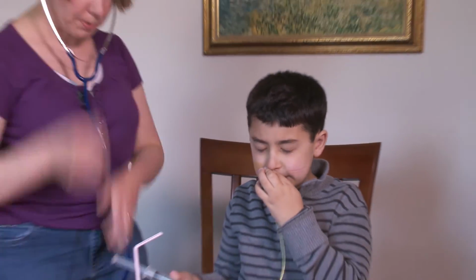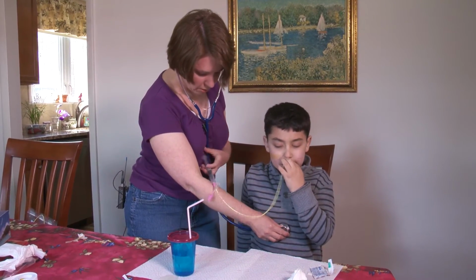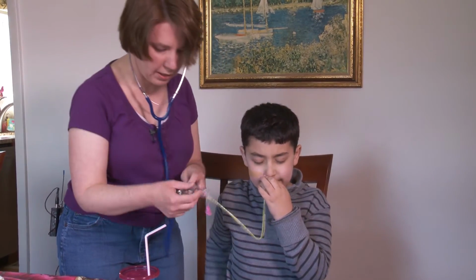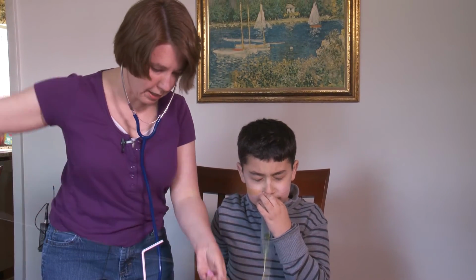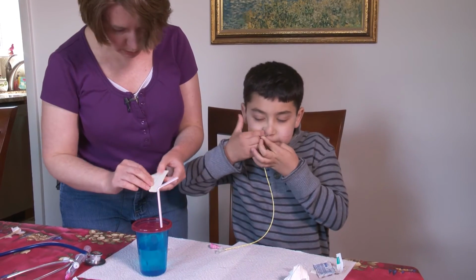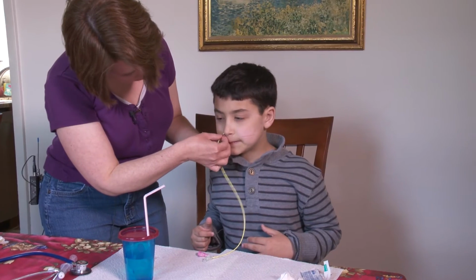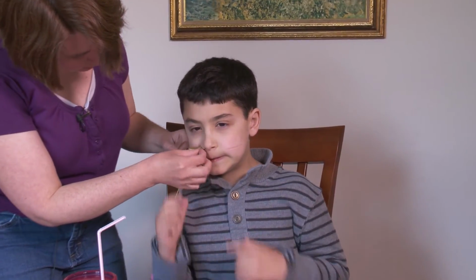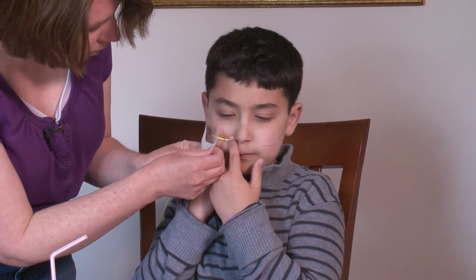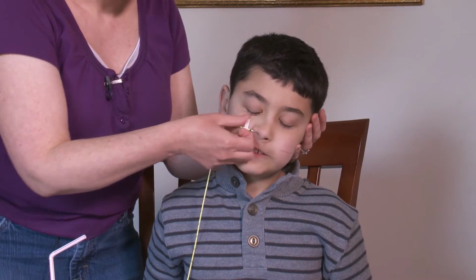So I put the stethoscope on, and I put it on his stomach, and I'm going to squirt some air until I hear it bubble, and then I'm going to take out the guide wire. Okay, great job. Now I'm just going to tape it loose because we're going to check the pH. So I know now that I did not put it into his lung. It's not in his trachea, right? You're going to hold it on either end, right? Because I heard the bubble go into his stomach. So I know for sure that it's not in his trachea.